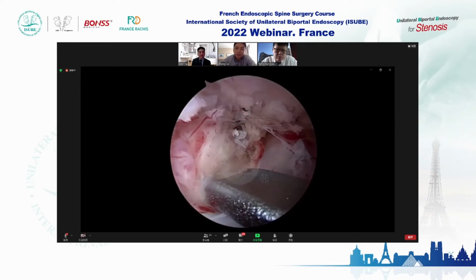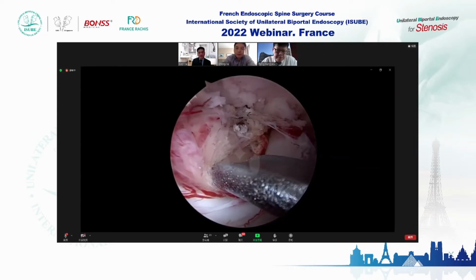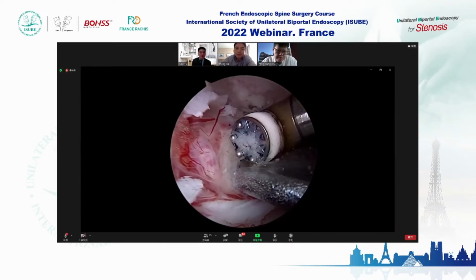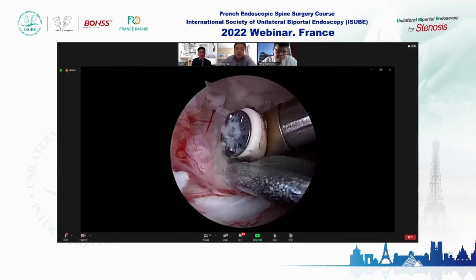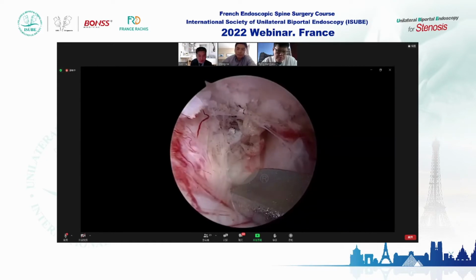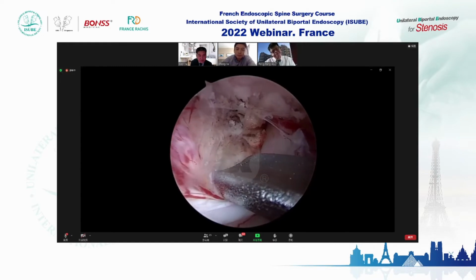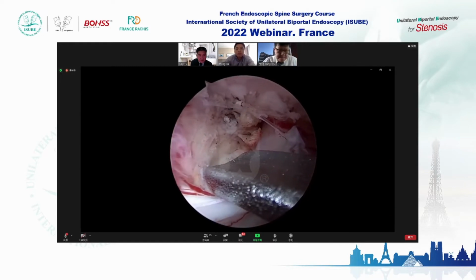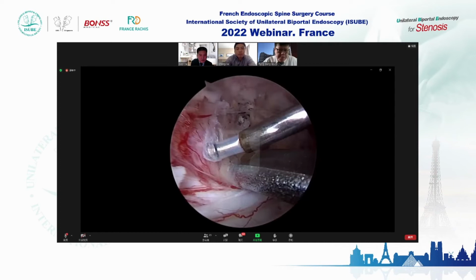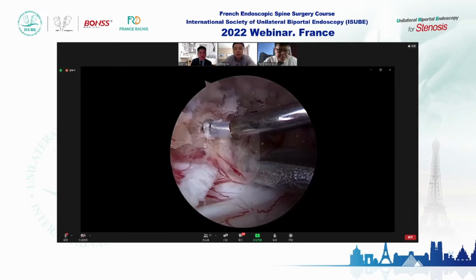To match the blood vessel on the surface of the disc fragment. No, I find the disc fragment. Okay, great job. But I will do the bleeding control first. So now the radiofrequency is through the third portal. But the left upper about 11 o'clock. So Dr. Zhang Wei. Okay.